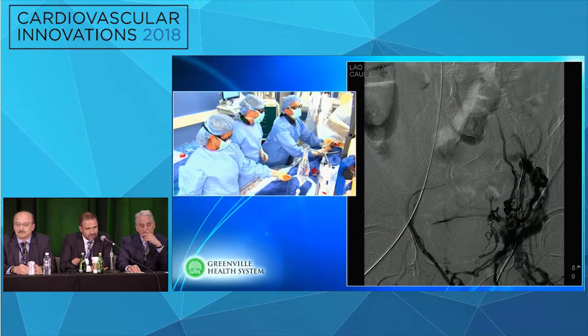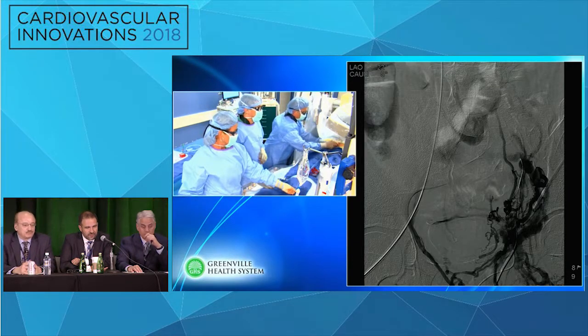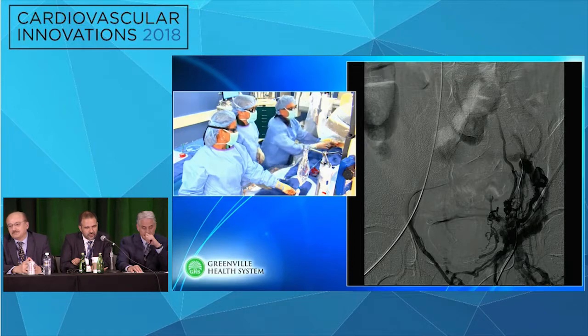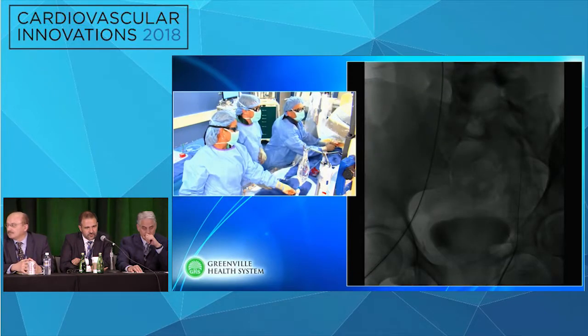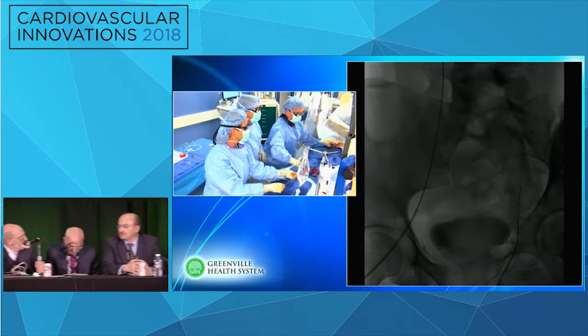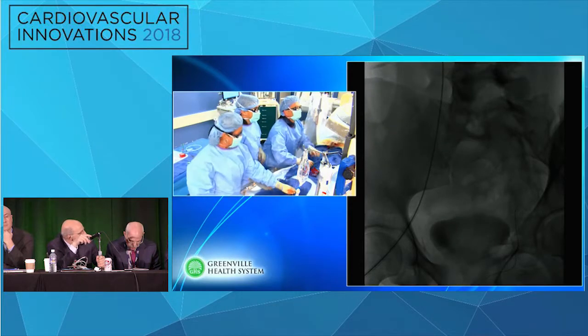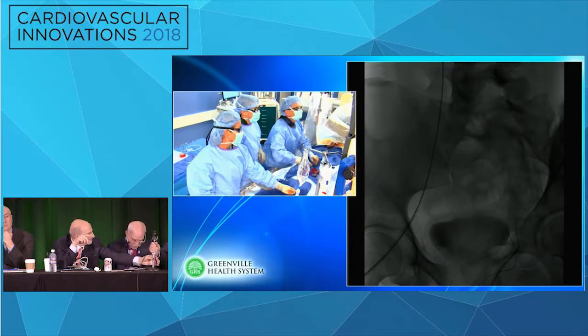But I think Carlos's point is a nice one, that if you had an MRV or some kind of imaging from before, it maybe would have told you where you are. This is a good application, if you had a CTV or an MRV and you could co-register with your fluoro, that would be a great application for this. You'd be able to see where it is. Peter? It would save you time and aggravation in the case.